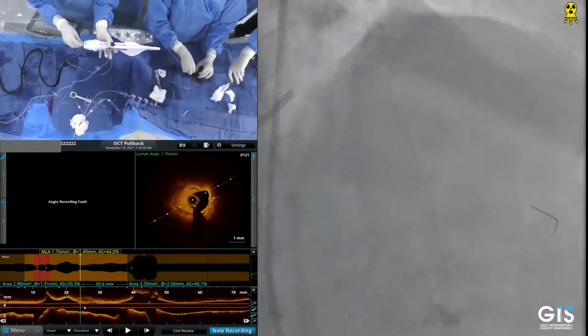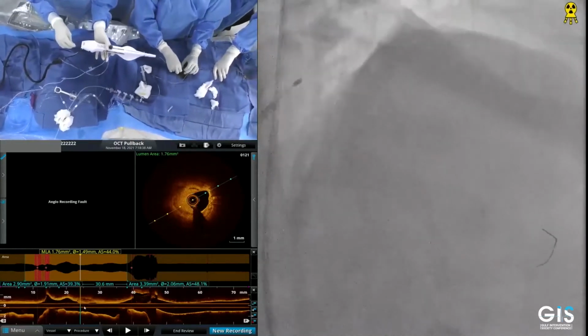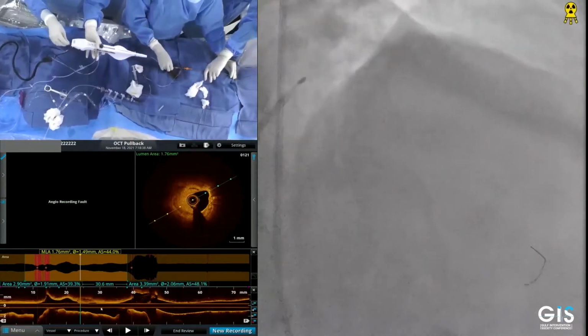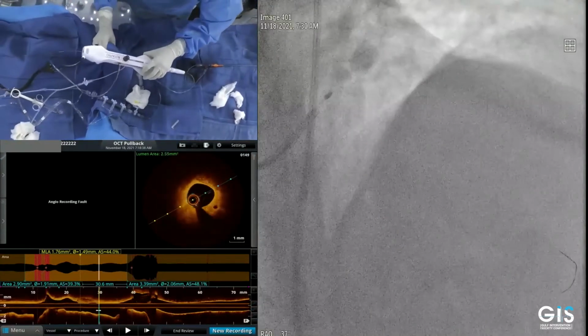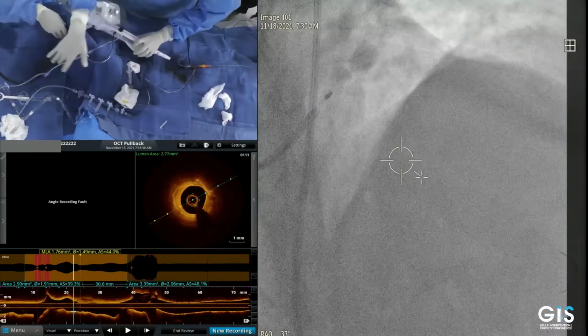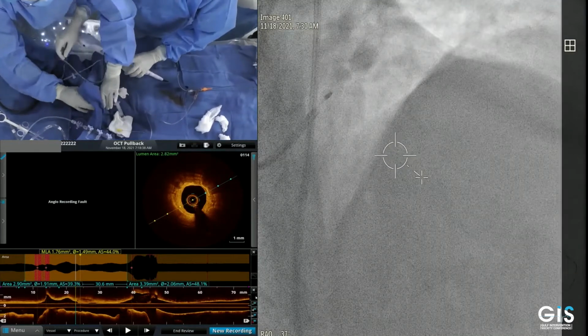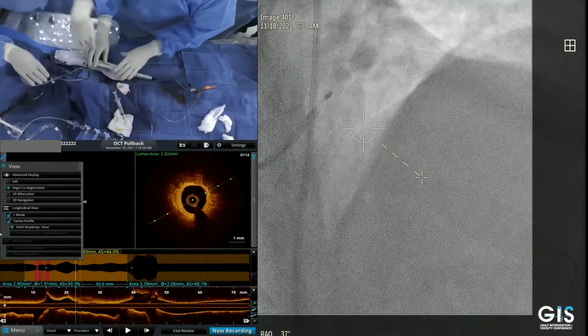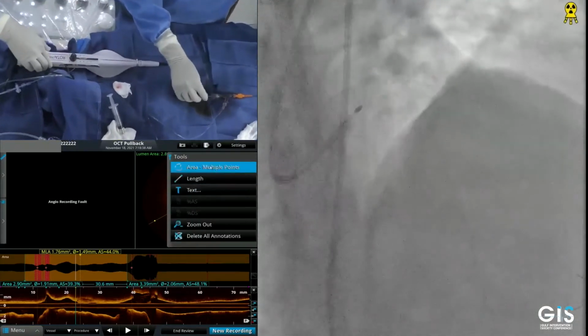And from then on, it's always operator preference. I also heard that the OCT may come in a shade of gray, and it's like IVUS. So we are used to shades of gray, but not used to shades of orange so much. And I think that may also be up soon. So meanwhile, we set up the rotablator because clearly that's what's needed in this long calcific lesion.